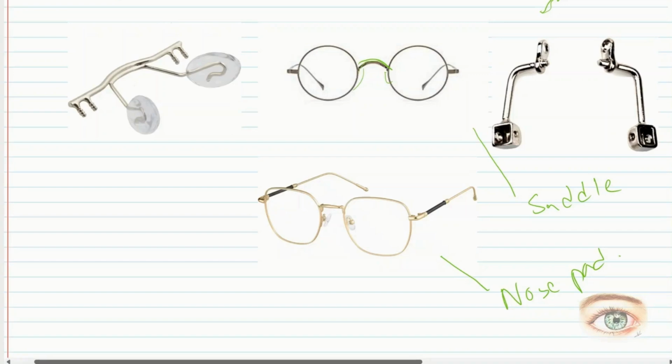This is a nose pad nose bridge, a metal nose bridge. We have these nose pads, rubber nose pads actually. These are pad arms through which these rubber pads are going to attach to the rim. These are the pad arms, and this is the pad. In metal nose bridges, the weight will only lie on the nose pads.